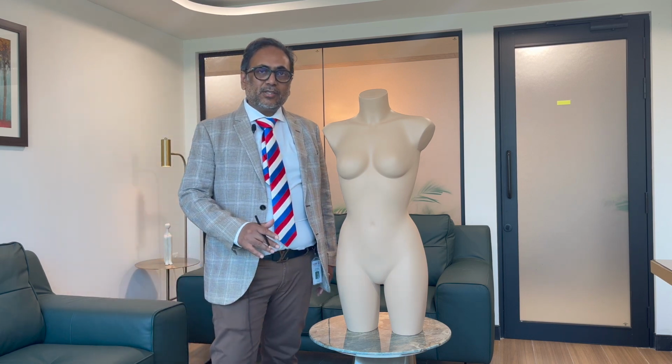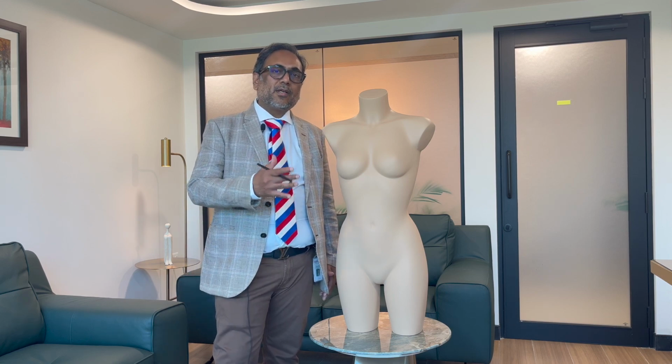But after the initial breast augmentation consultation, the examination is the most important part, and this is exactly what we are interested in this video. We are going to be showing what all happens during the examination when a patient is seeking breast augmentation. There are a lot of measurements which are taken when the patient comes in, and we're going to be marking all the important measurements which are required for our calculation of choosing the right breast implant.